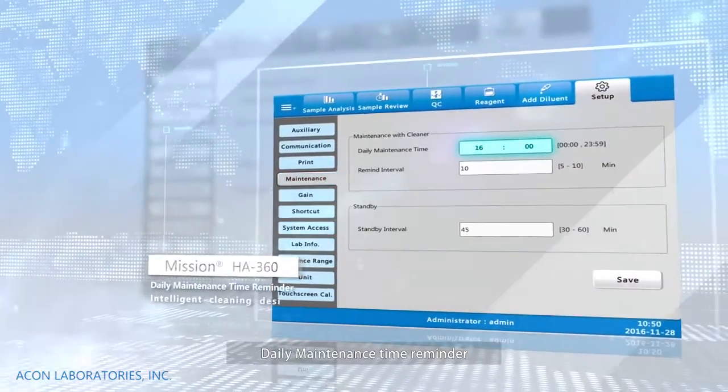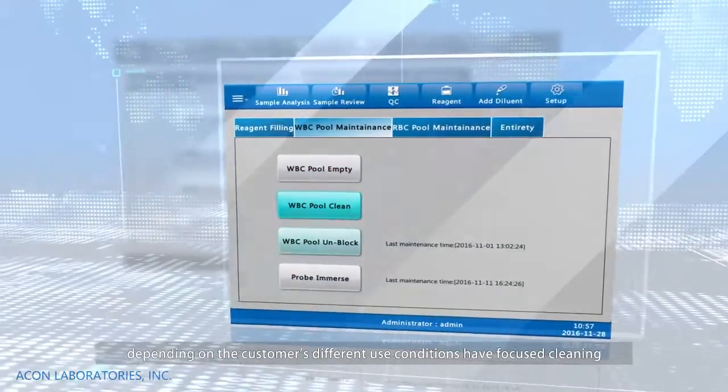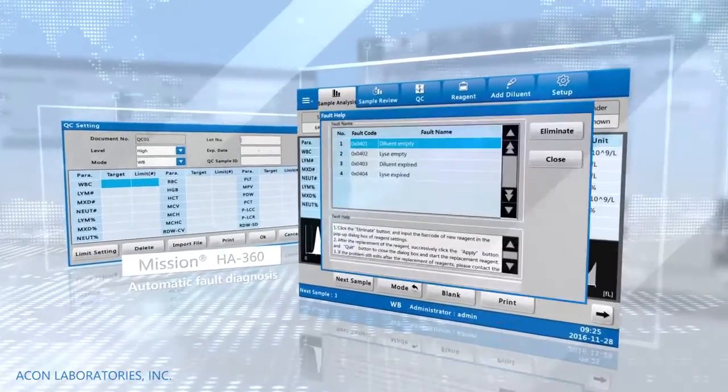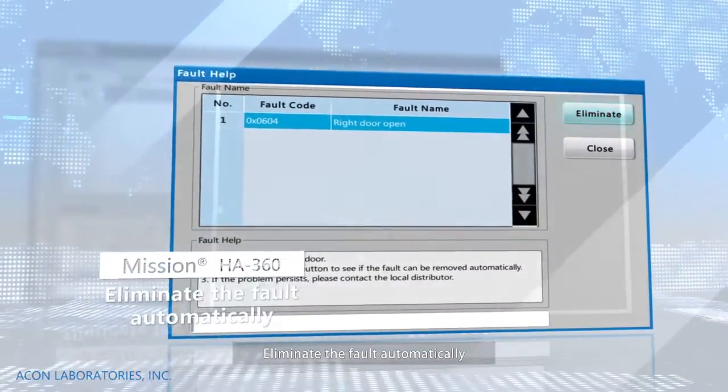Intelligent maintenance system with daily maintenance time reminders, convenient for daily work. Intelligent boot cleaning design adapts to different customer use conditions for focused cleaning. Eliminates faults automatically.